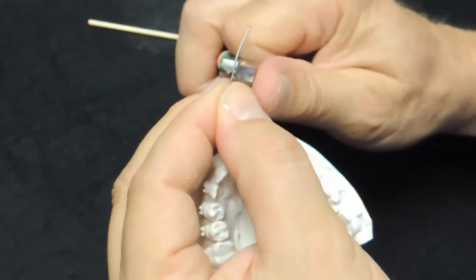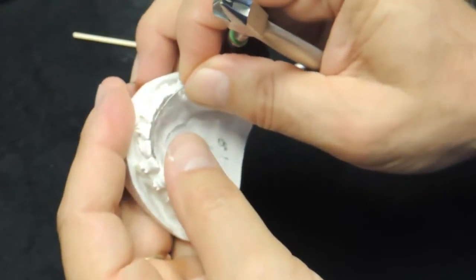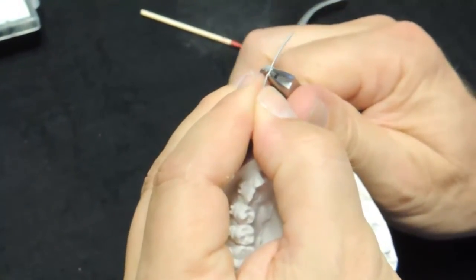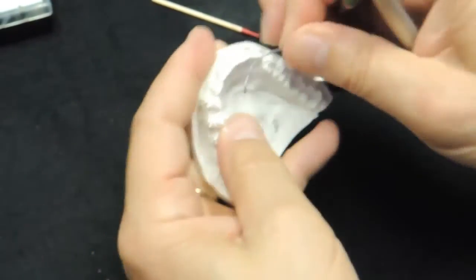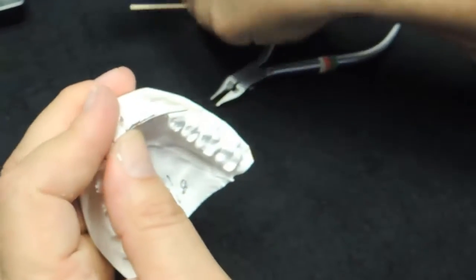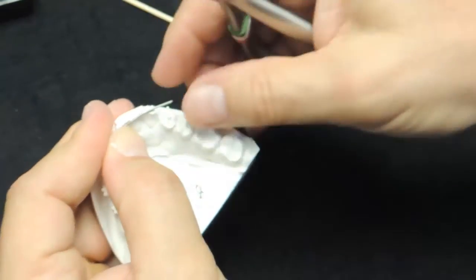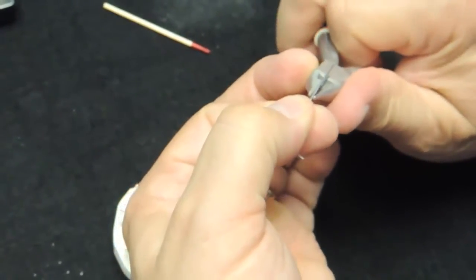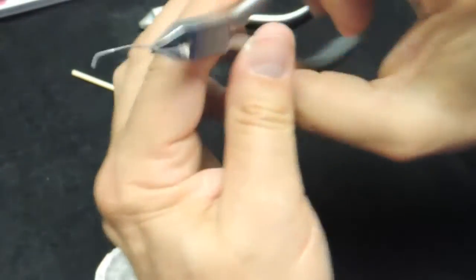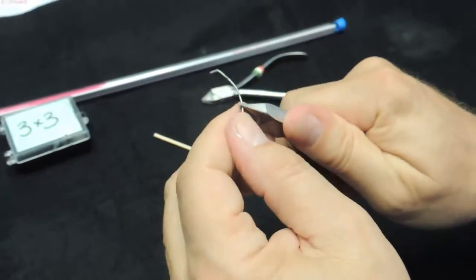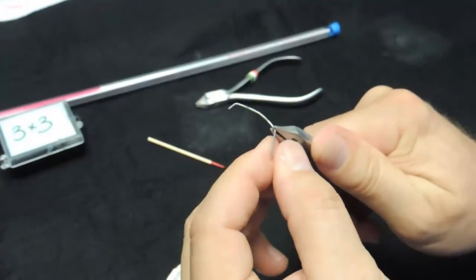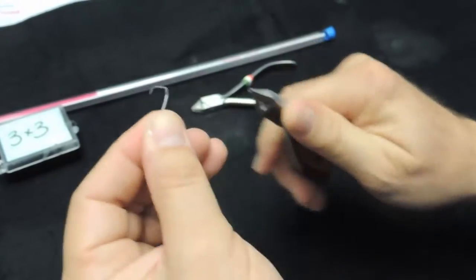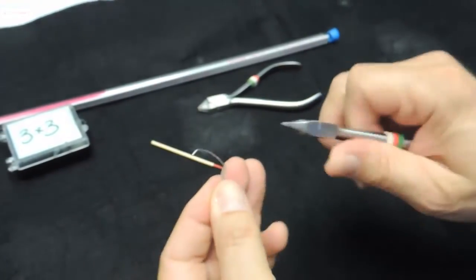A little bit more, and then I'll mark the next 45 degree bend point. I'll put the 45 degree bend with the bird beak. Now that bend is going to perfectly parallel the bend on the other side. You can easily do that if you leave the end of that wire a little bit long, you can control it and make the two sides parallel each other, and then cut off the excess.